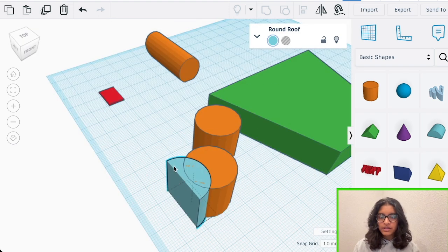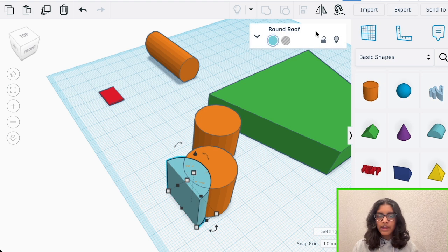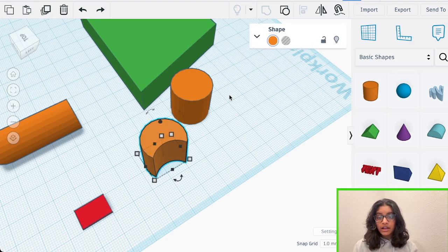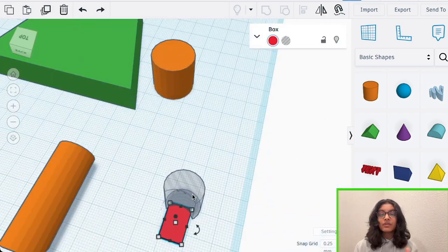Just overlap your semicircular shape or semi-cylindrical shape and your cylinder, and then make your semicircle a hole and group those objects together. Then make this entire object a hole, and you can adjust it to match the bottom edge of your fingernail. So after you've gotten the curve how you want it to be, just group those objects together.